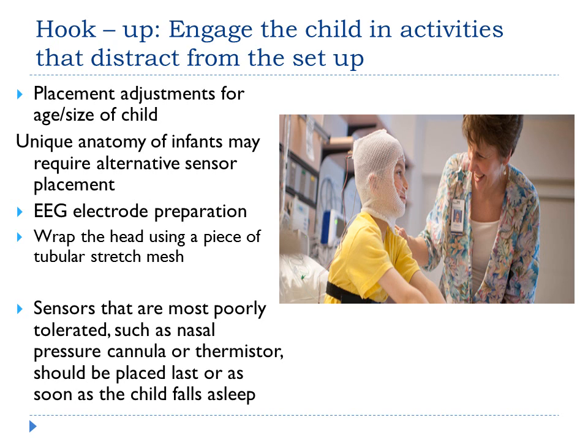Some other factors to consider with your patient's hookup, especially with your infants, is your placement of electrodes may need to be adjusted a little bit. Because of their smaller head size, you may need to use 6mm electrodes. Your distance between your chin EMG leads in small children might need to be reduced from 2 centimeters to 1 centimeter. The EOG electrodes may need to be placed 0.5 centimeters from the outer canthus as opposed to 1.